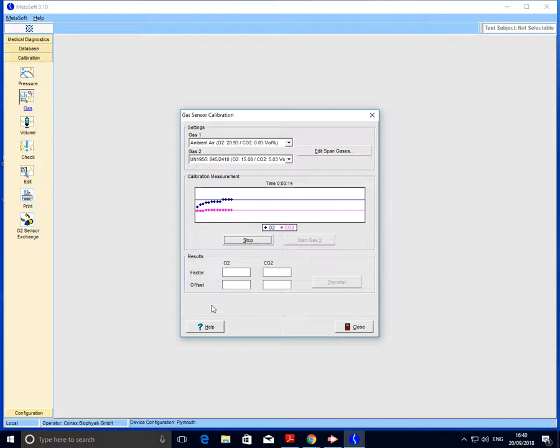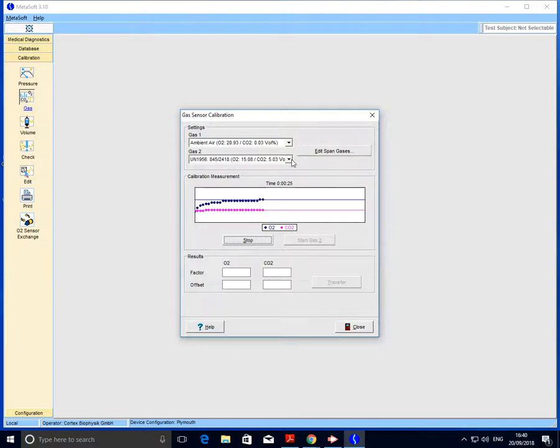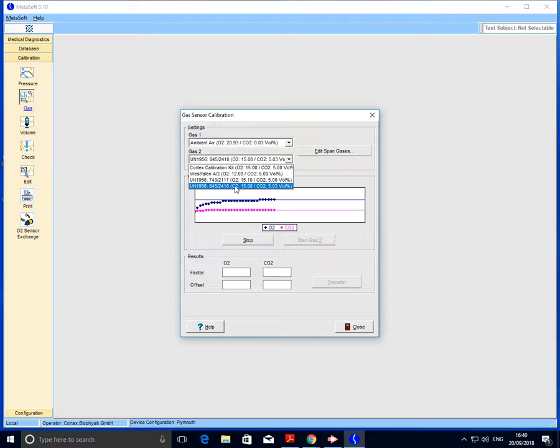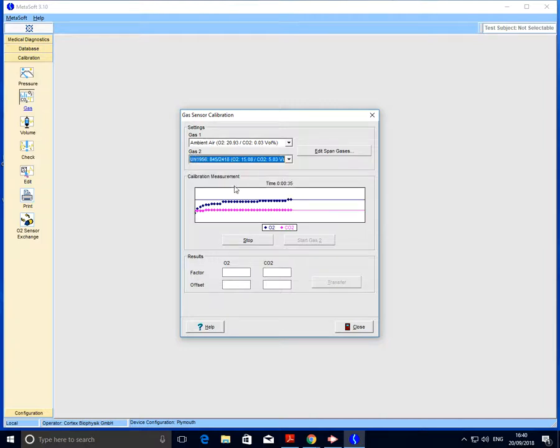For gas two we need one of the gas canisters, and essentially what we need to do is match up the batch number displayed on the label of the canister with the batch number of one of the gases within the drop-down menu. For example, I have the gas canister that relates to this 8452418 batch number. If I select that one, I can be confident I'm using the correct canister.